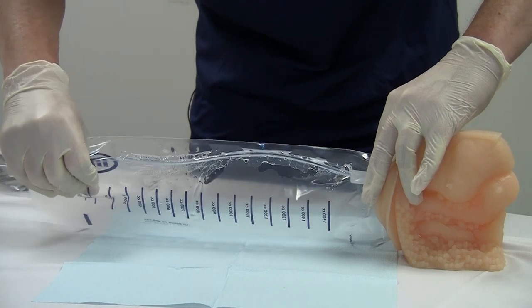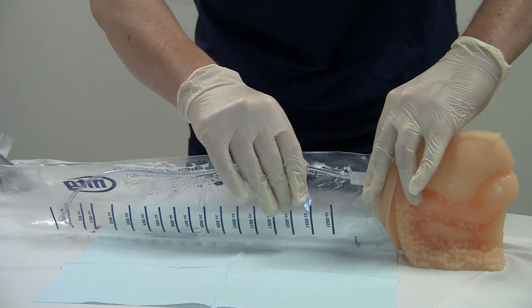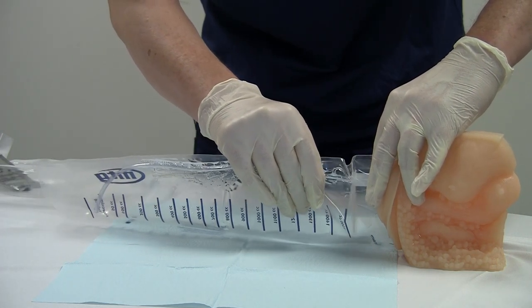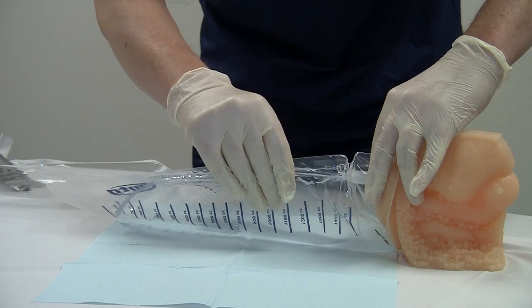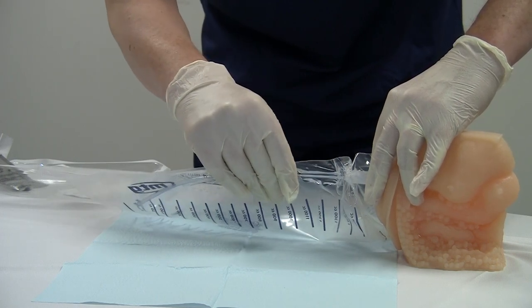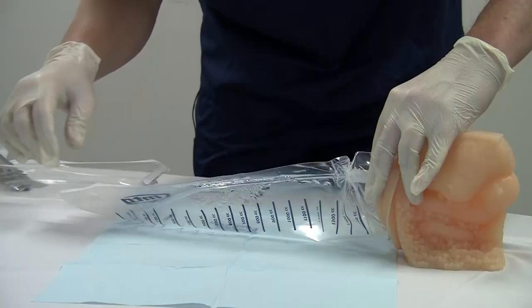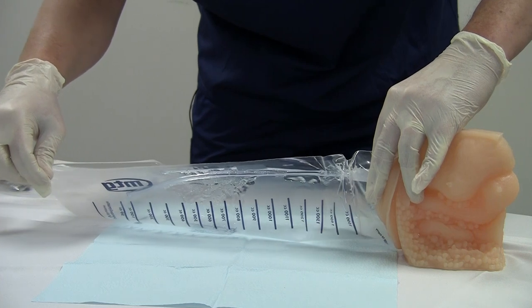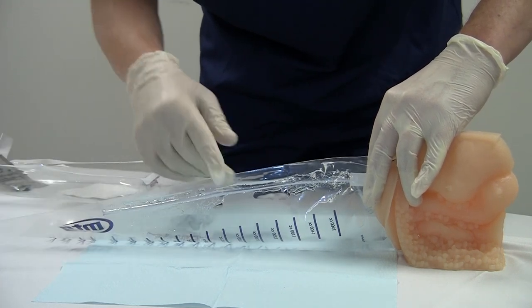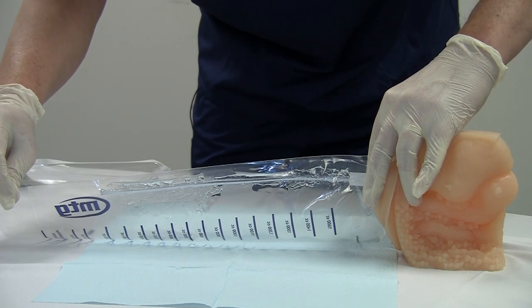Another helpful hint here is to pull the catheter as far up in the bag as you possibly can, just like so. Now I'm ready to advance the catheter 1 to 2 inches at a time. With the female, you only have to put it in about 2 pushes before the catheter reaches the bladder, and then 1 more push once we see urine to get the catheter right in the middle of the bladder. And then straighten the bag out, position the bag between the patient's legs just like so, and the urine will pool down here at the bottom of the bag.